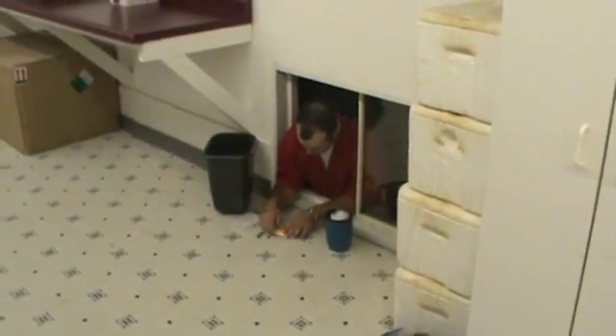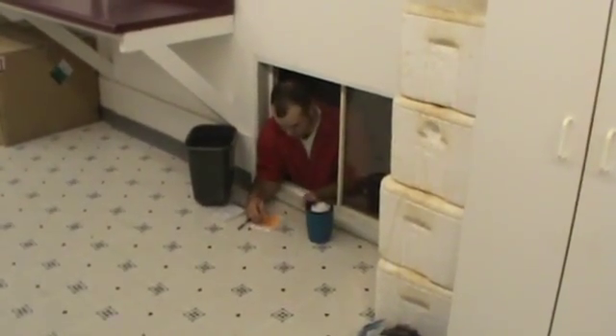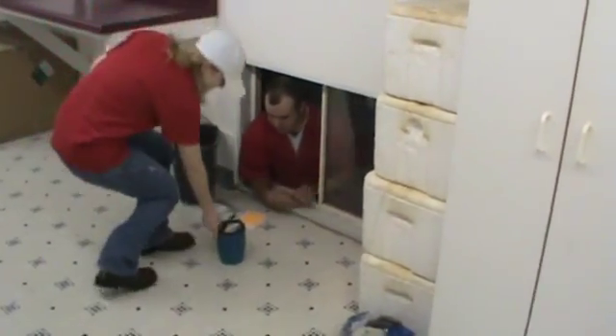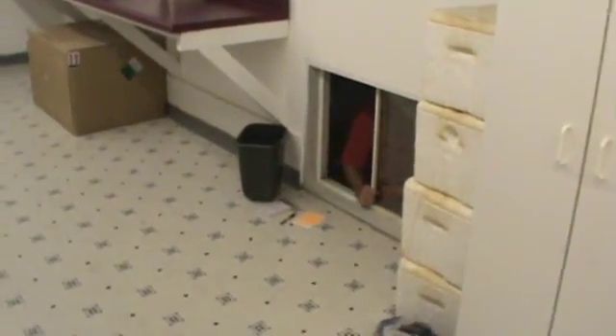Quick tour on how we process semen here at Prairie State. As you can see, Jason, our collector here, has just got done collecting a boar. He is labeling the boar and passing through the little McDonald's pass-through window we have here. One of our lab girls will then take it back and we will begin processing the semen.